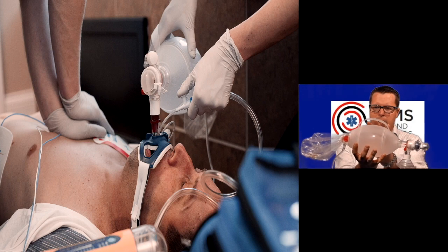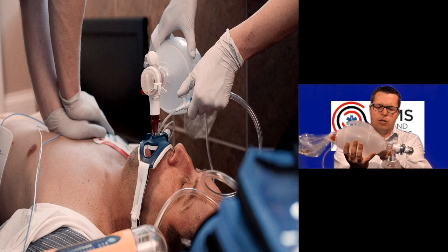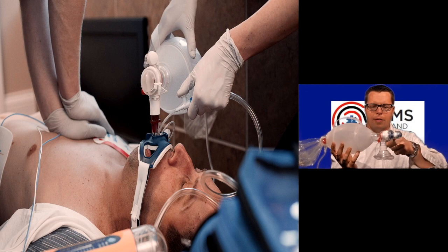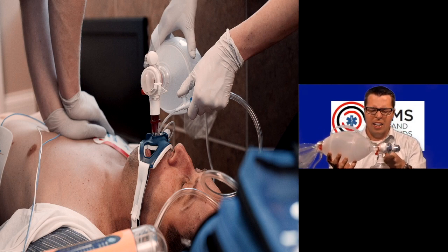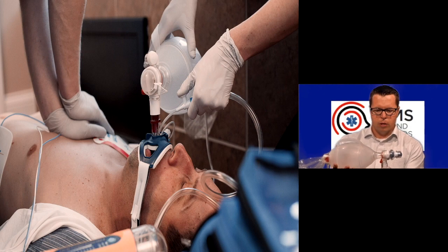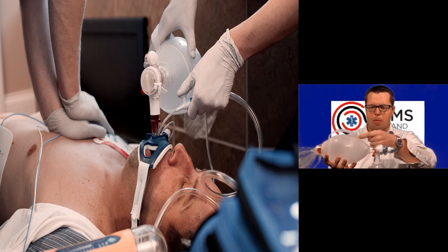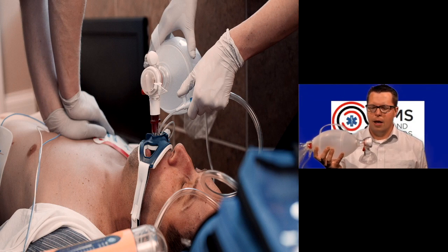Anyway, it goes into this chamber here, this bellows chamber. When you squeeze that, air is forced out of this part and through this one-way valve, down through the mask or the ET tube or whatever the inlet port is into the patient. The patient's lungs do something with it, and then the patient tries to expire. Air comes back out, hits this one-way valve, can't go back in through this bag, and so gets directed out the exhalation port of the bag.